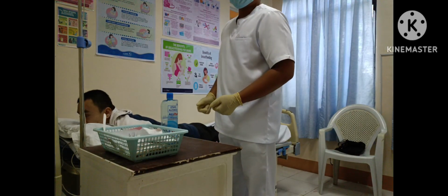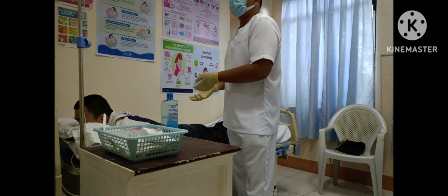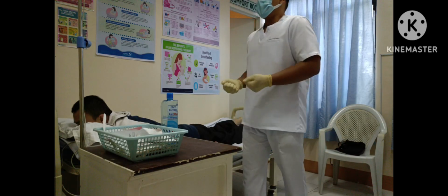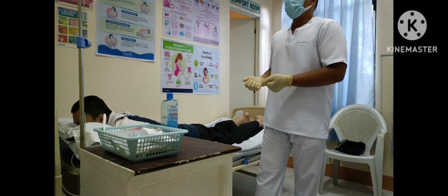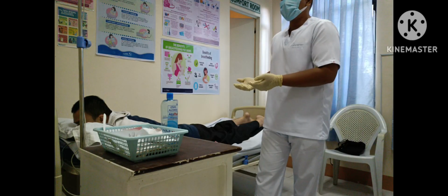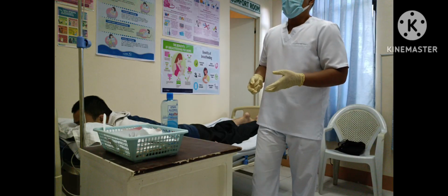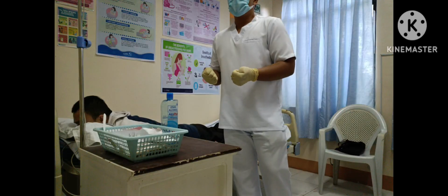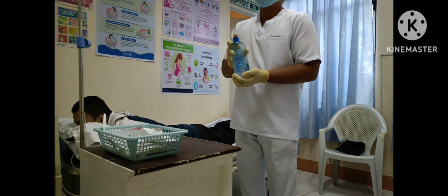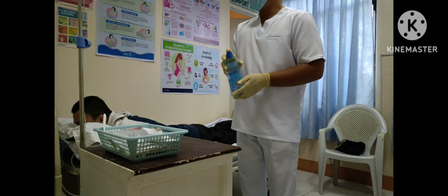And it's important that we put the patient in a supine position for 2 to 3 hours. After doing that, it's important for us to position the patient again in a more comfortable position. And after the procedure, it's important for us to do hand washing, do aftercare, and make sure that the sample that we collected is sent to the laboratory for examination.